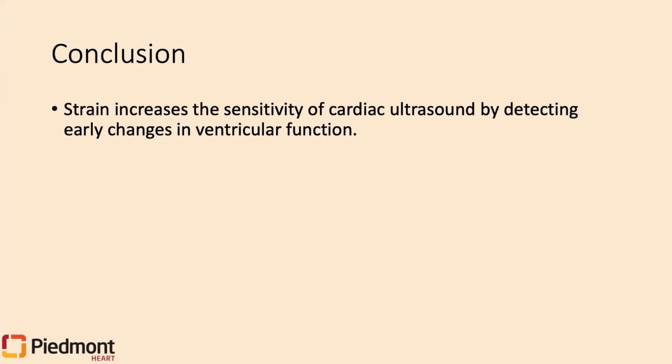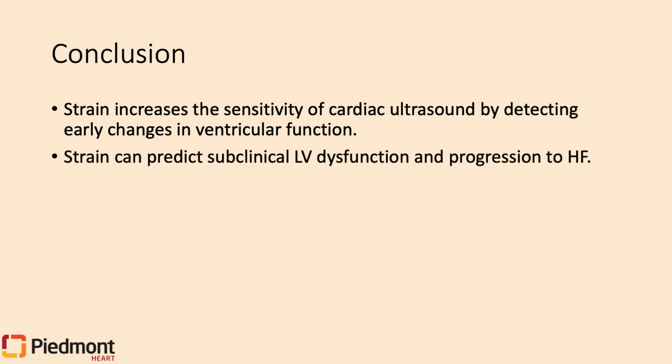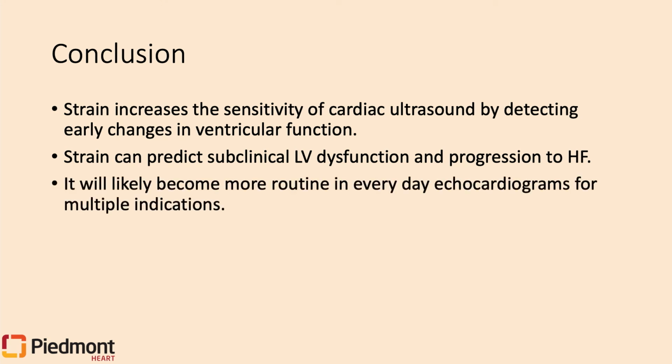So in conclusion, just a reminder that strain increases the sensitivity of cardiac ultrasound by detecting early changes in ventricular function. As a result, it can predict subclinical LV dysfunction and progression to heart failure. It will almost certainly become more routine to see strain in everyday echocardiograms for multiple indications, and so I can't emphasize enough the importance that we get comfortable with this modality and work together to make this commonplace in our echocardiograms. And in order to do that, practice is key.